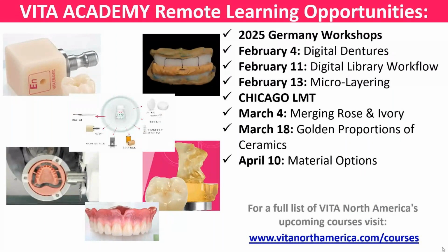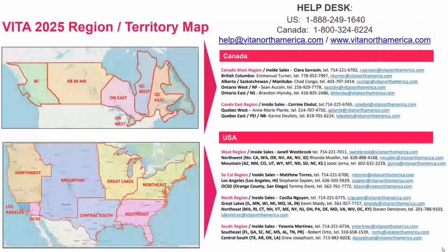So if I use a glazed paste, I'm mixing it sometimes with, what's the material? I forget the name of it. It's a VITA material, finishing agent, right? I might mix that with a little bit of finishing agent, and then when I'm done glazing it, I break it with a rubber wheel and then come back and polish with diamond paste. Or you can use a regular denture polish. But in the end, I think what's hurting us most from the final topography is if you're layering and you're still just using glaze pastes, you're defeating the purpose of your surface texture and final luster.